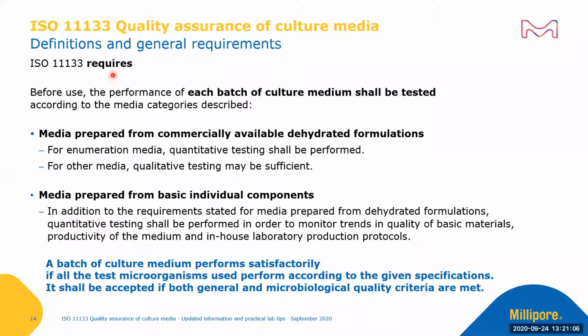ISO 11133 requires, before use, testing of each batch of medium prepared from commercially available dehydrated formulations. For enumeration media, a quantitative testing shall be performed, and for other media, a qualitative testing may be sufficient.